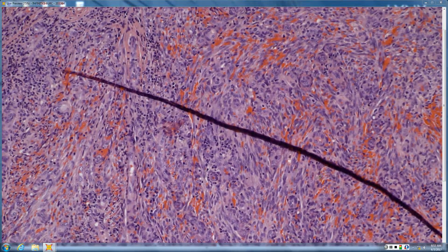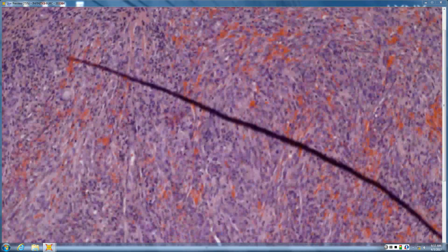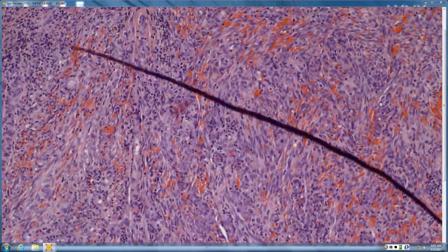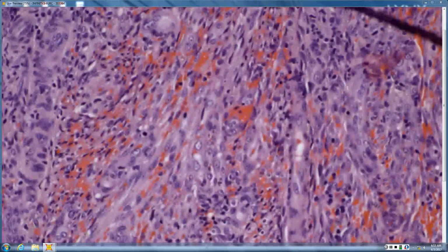There still are some remnants of kind of this slit-like vasculature architecture, and then there's this layering in of these red blood cells, and ideally you even see single file erythrocytes, kind of through here, which is basically just how packed in they are.